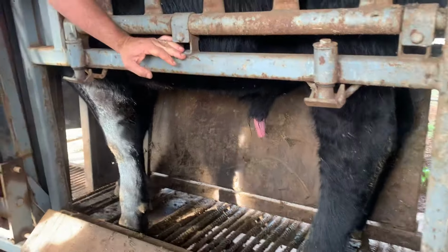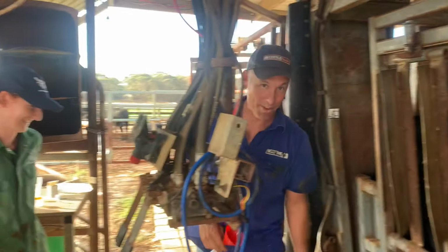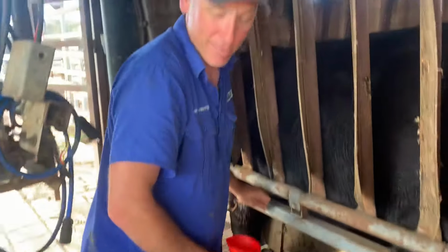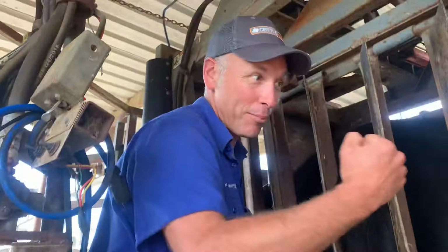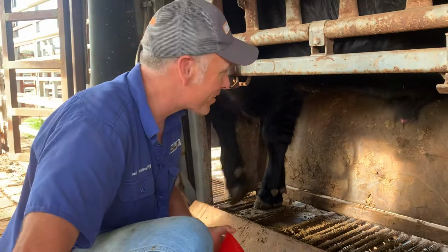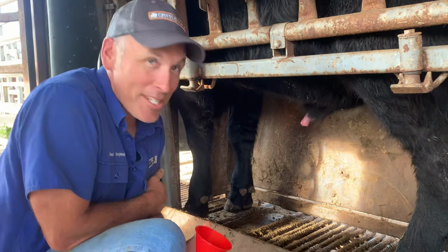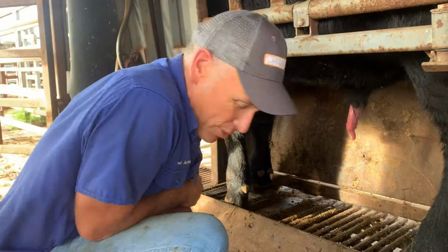Hey, Jack. Tell the story about coming through the airport. Yeah, this is fun when I brought it into Australia. At the border, they pulled me up. What are you declaring? I was like, an electro ejaculator? Like, what's that? Oh, yeah, we're collecting bull semen. He's like, can I see it? And I pulled it out, the big probe. The guy about fell over. You want to catch semen? Okay, no worries. You could be Electro Jack. So it's the Pulsator 5.